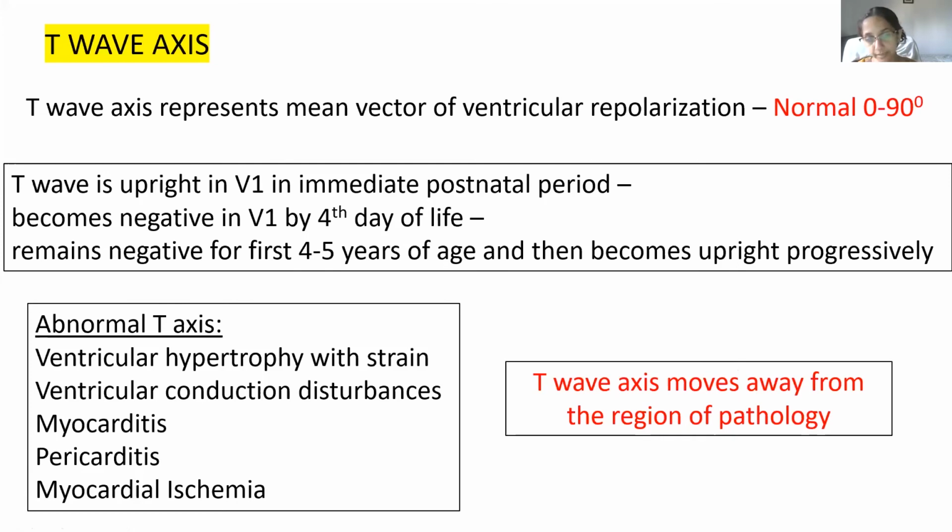This is important. We will see in the subsequent slide how an ST segment axis changes. Because a lot of times as a pediatrician, when we try to think, we think some T wave changes, some ST changes, elevation, depression, everything is confusing. But these two principles we need to understand. One is the T wave axis moves away from the region of pathology. The ST segment is in a different way.